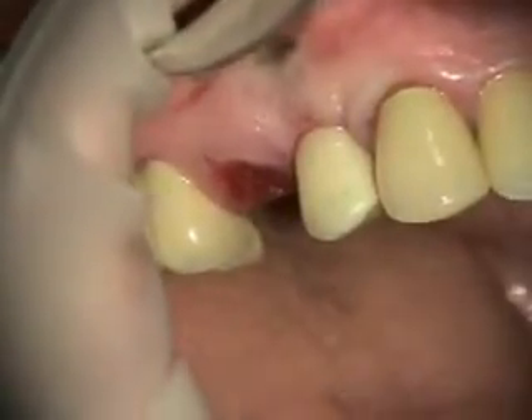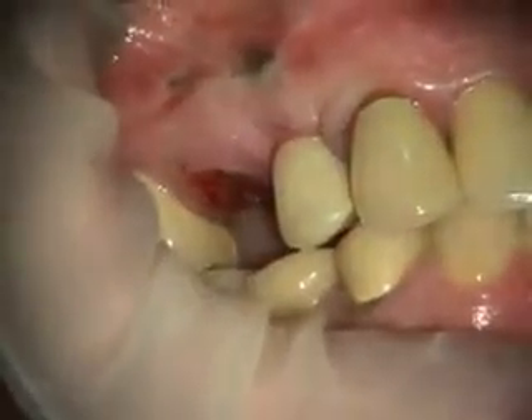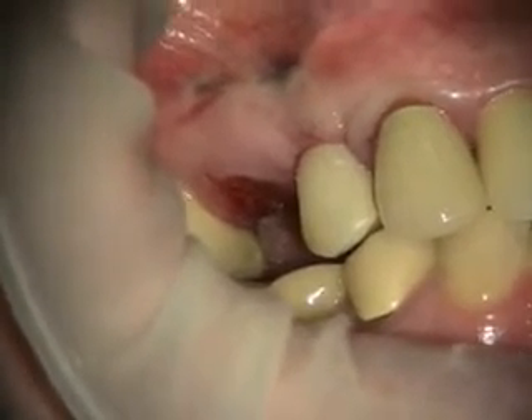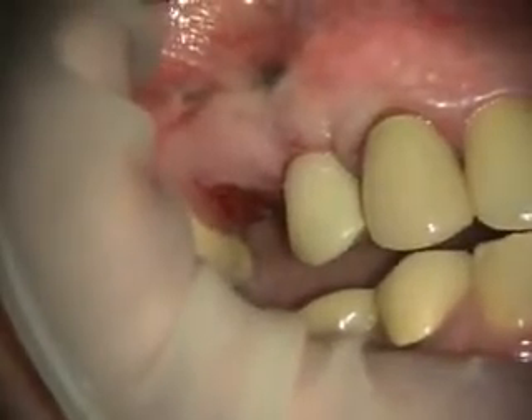Okay, now bite together. Good. Slide to the right like you did before. Okay, slide straight forward. Good. Okay, open.